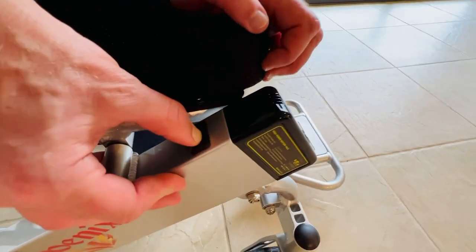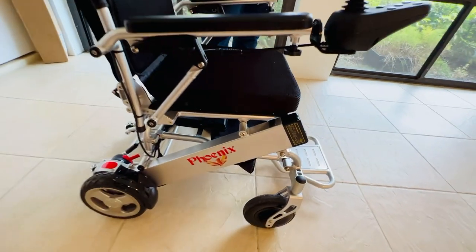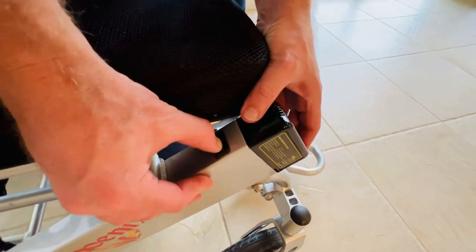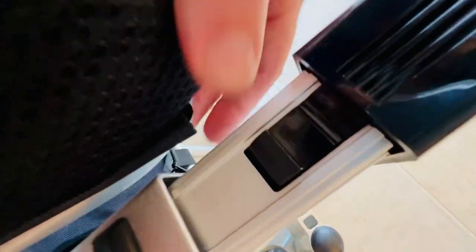There is a button, and if we zoom out a little bit, we can get a sense of the button's position on the frame of the chair. We can see that the button is right on top here. I just press that and that releases the battery. You can see the latch right there on the battery. I'm able to take the battery out — there's one battery.